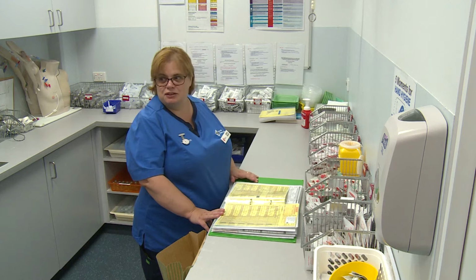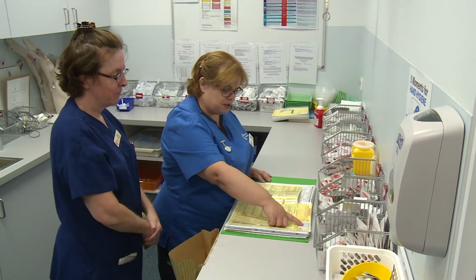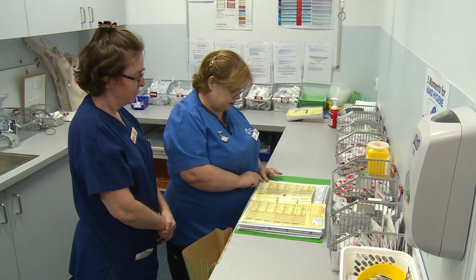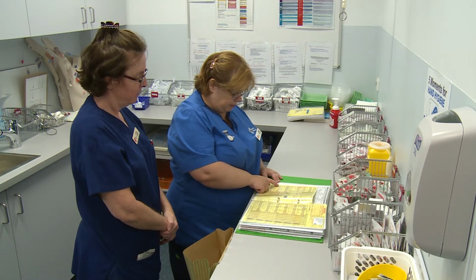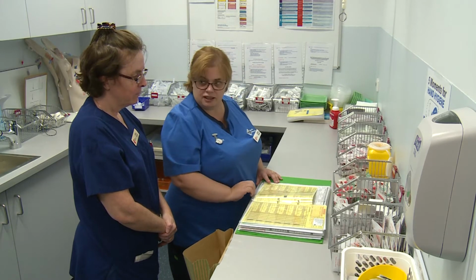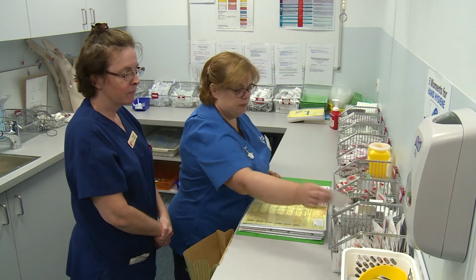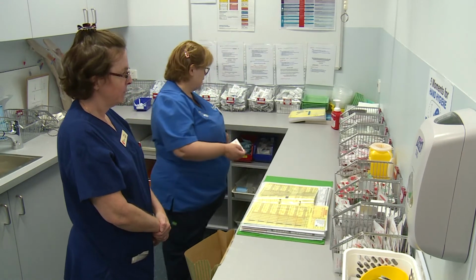Hi Jerry, are you free to do a drug check with me? Yes, what would you like to check? Okay, so I'm looking after Thomas Hoggs, and he is due his amoxicillin, 1 gram IV, and it's due at 12 o'clock, signed by the doctor, and he's actually not allergic to that. Great. Okay, so I'm just going to get what I need to get this ready.